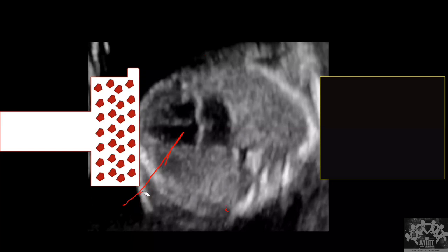So that's how we give anesthesia. In anesthesia, we see the nerves and the vessels next to them. We send a needle and give the anesthetic around the nerve without injuring the vessel and without injecting into the vessel, which could cause the nerve to paralyze. That's how we use B mode. That's what I know about anesthesia. I don't know if they are trying to use M mode recently, but I don't think M mode can be used that way.